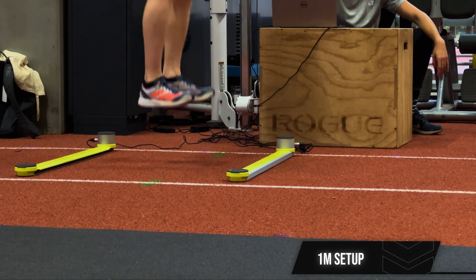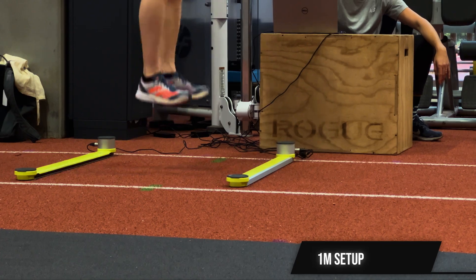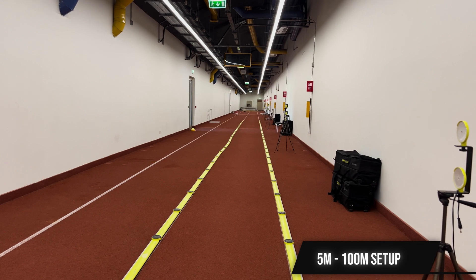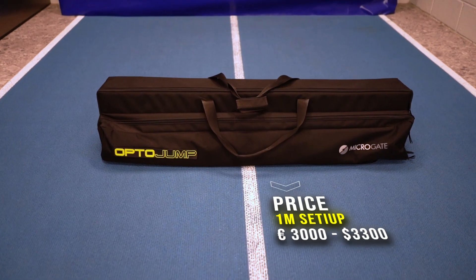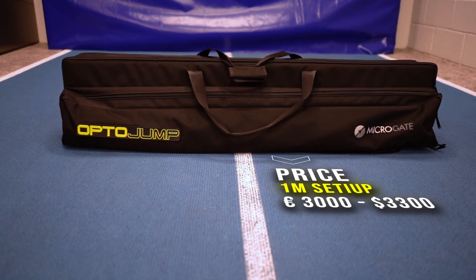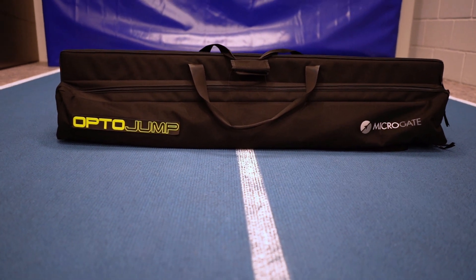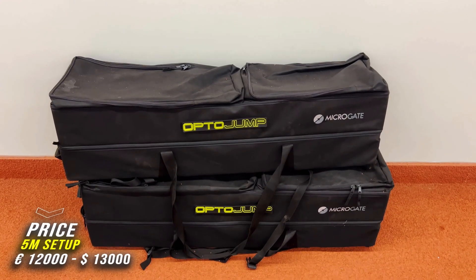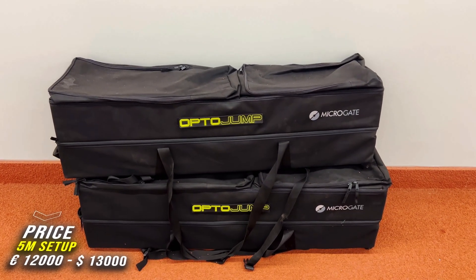The OptoJump can be bought as a separate 1-meter strip or a full 5-meter or longer setup, possibly even up to 100 meters. The price of a 1-meter setup comes in at around 3,000 euros or around 3,300 US dollars at the time of recording. For a 5-meter setup this will be 13,000 US dollars or 12,000 euros.